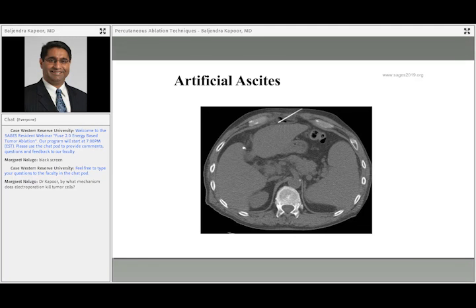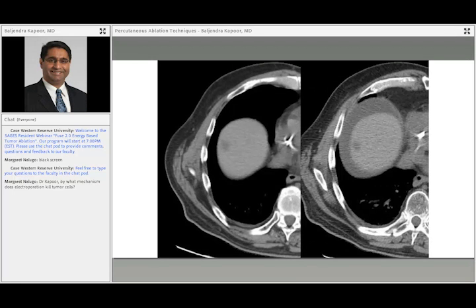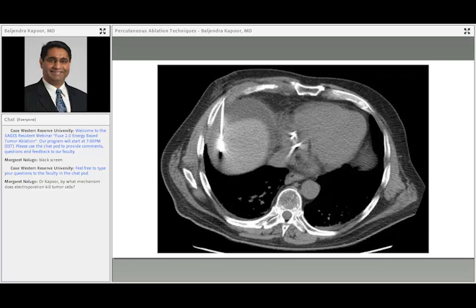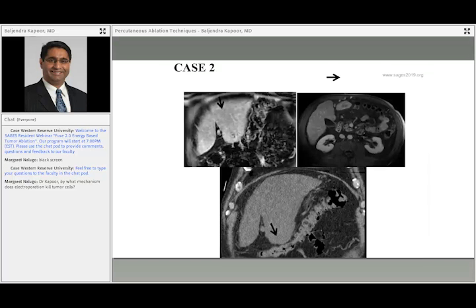The key is that the fluid should not accumulate at the tip of the needle, which is what is happening here. You can see the fluid in this area, but you don't see it at the tip, so it is appropriately placed. This was the lesion right up at the top of the liver in segment 8, and here you see the artificial ascites. Then Dr. Ariano was able to get to the lesion through the ascites and successfully ablate this area.